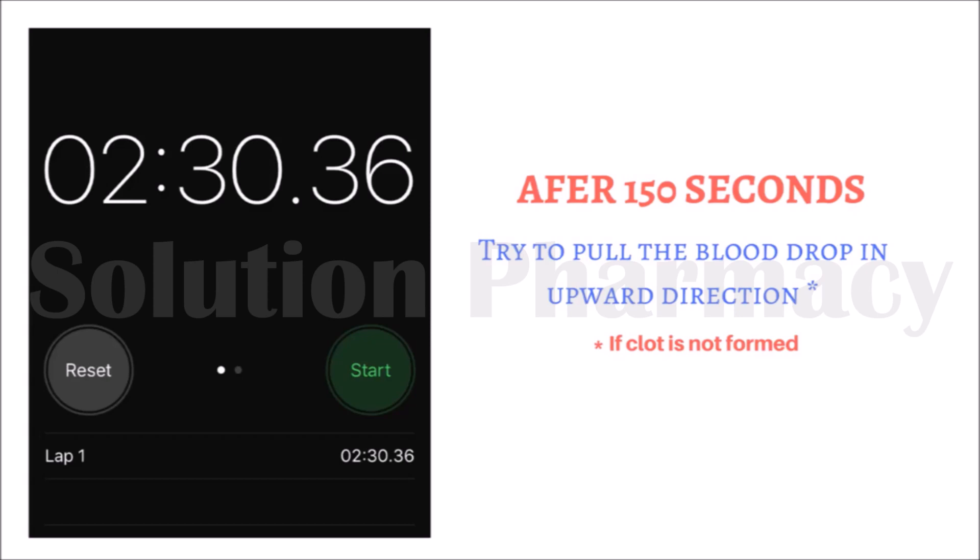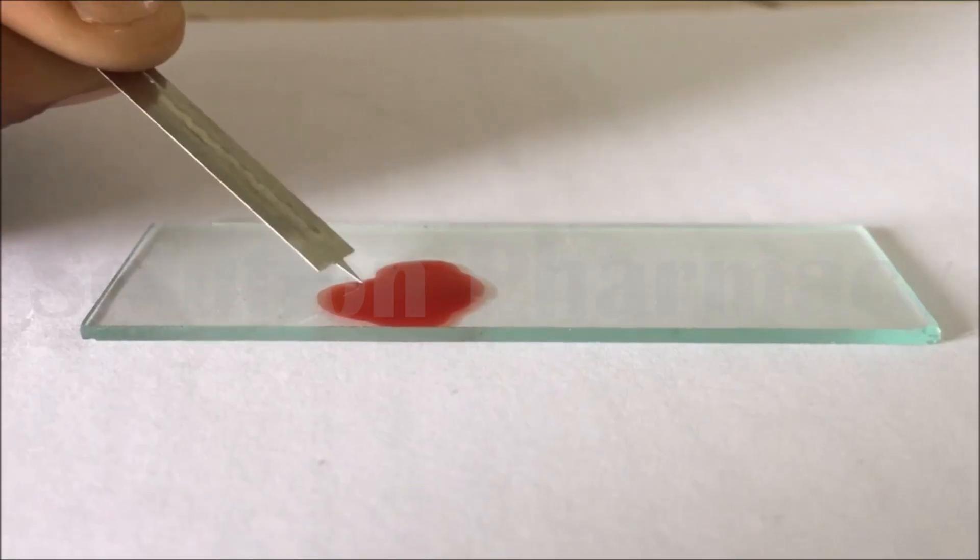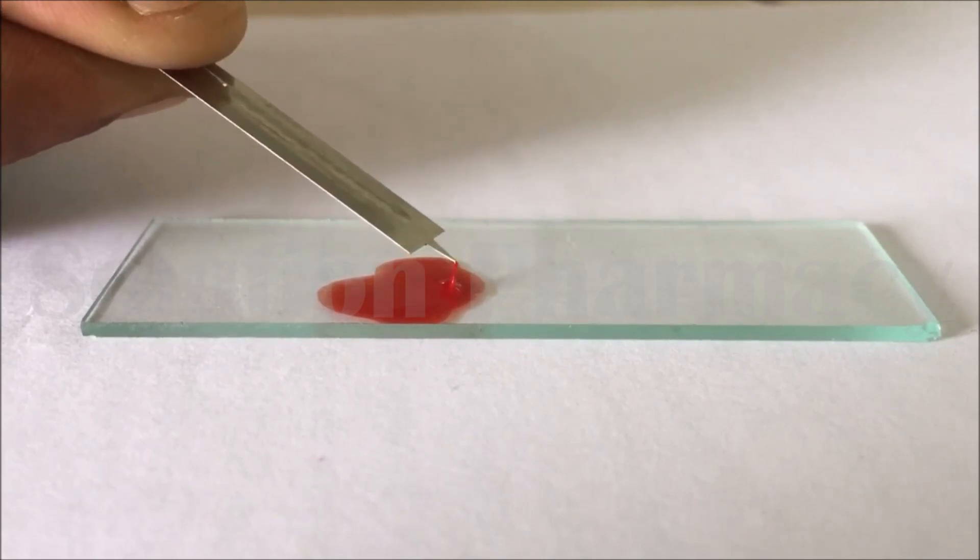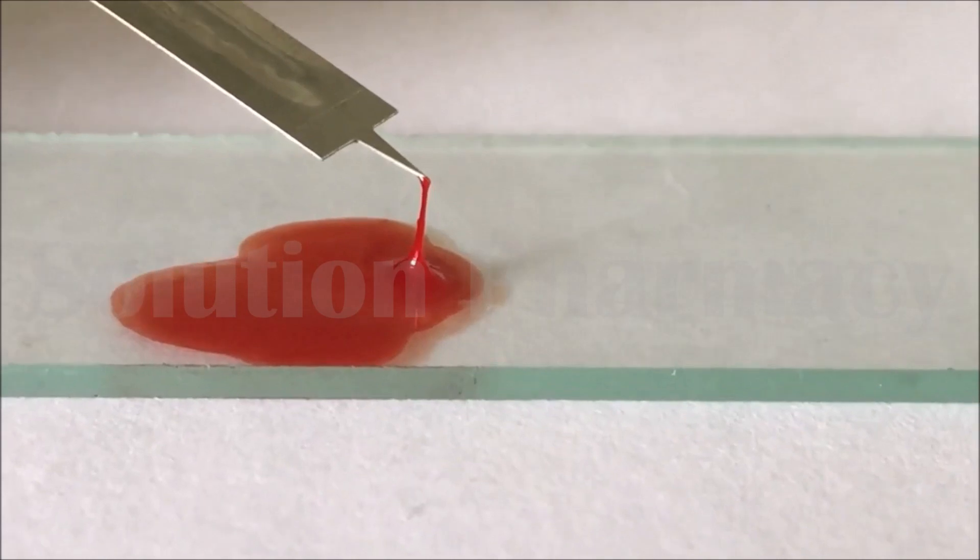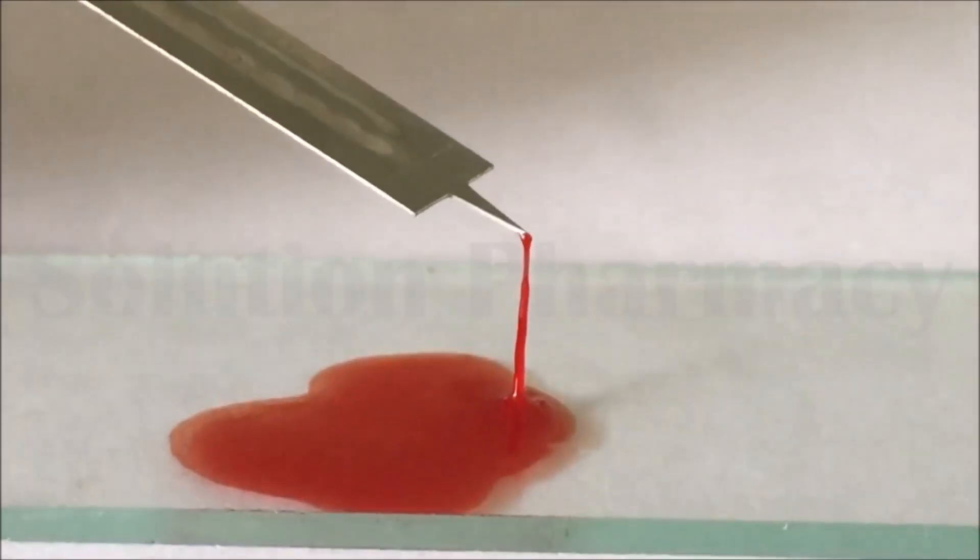Finally after 150 seconds, again repeat the same process. Try to pull the blood drop on the slide with the help of lancet tip. Pull upward slowly. You can see here fine thread, that is fibrin thread of the clotted blood.